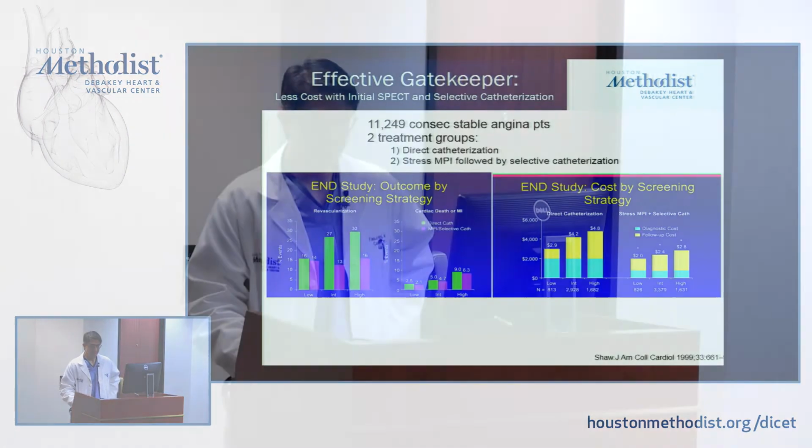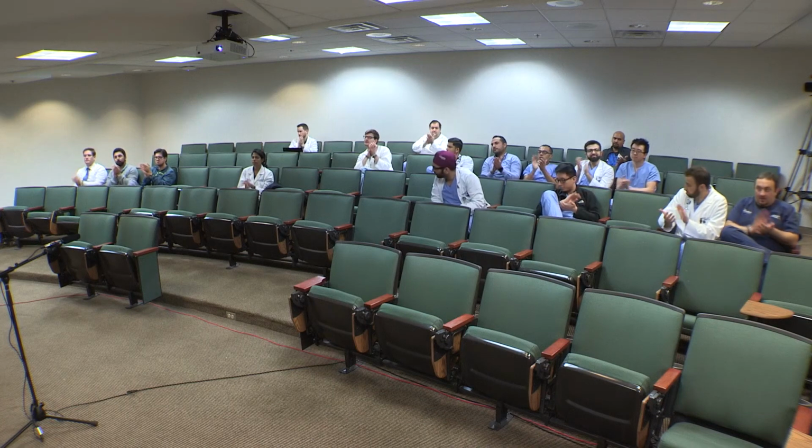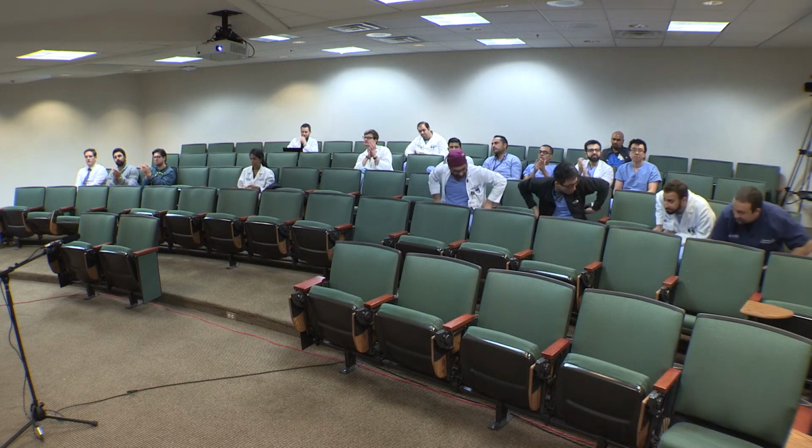And I will leave it at that for anybody who has any questions. I guess we can say that this is retrospective data. We do use this on a daily basis, how we use the perfusion abnormality when deciding whether we'll treat somebody medically or with revascularization. So a lot of this has been done, and we have set this 10% cutoff of ischemia in our minds.